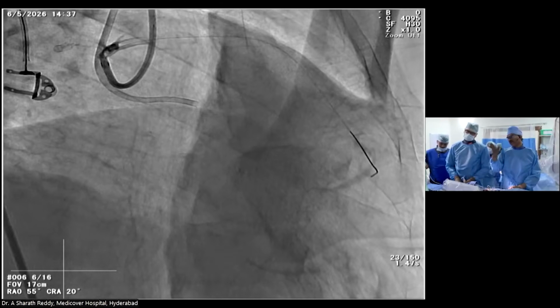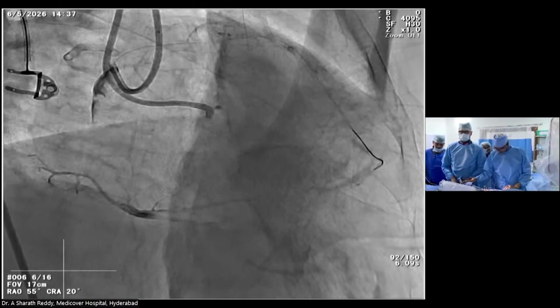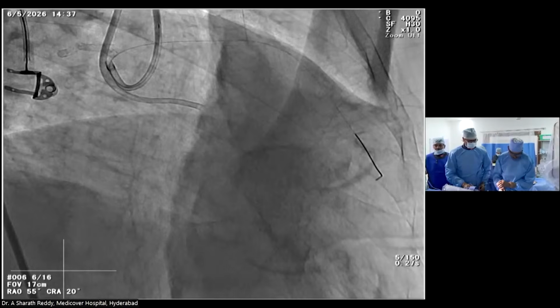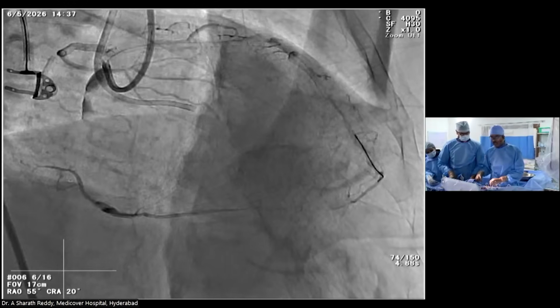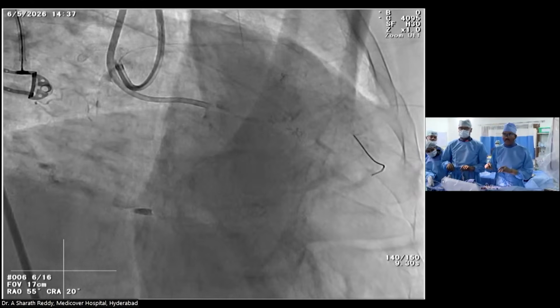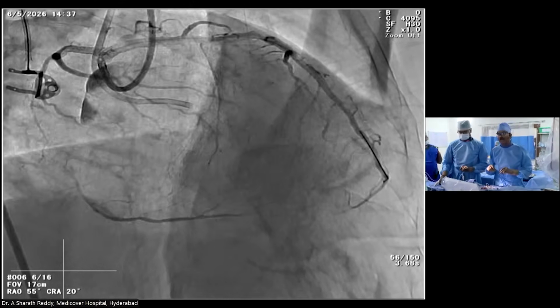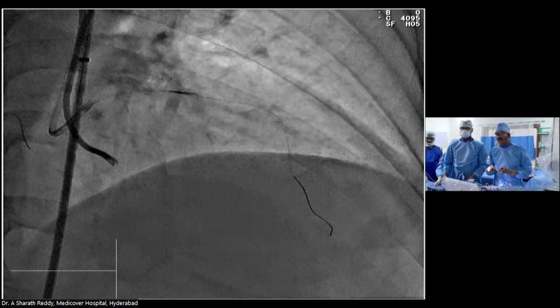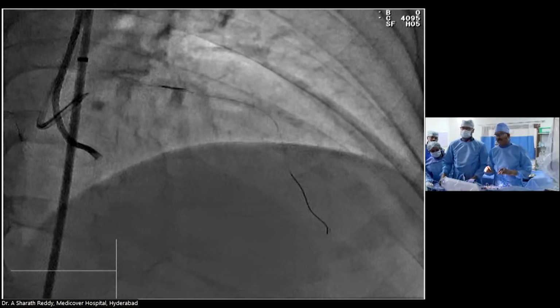The second one is based on the CT, as we decided. And importantly, simultaneous injection doesn't mean injecting simultaneously, but waiting until the filling of the distal retrograde comes and then the antegrade, because sometimes we see really. In the first picture of dual injection, you took the antegrade first and then you injected the retrograde. So can you show it again, Sharath? The first dual injection?